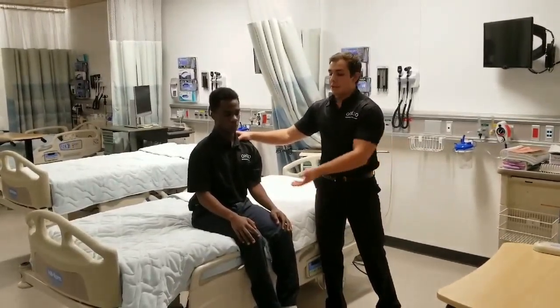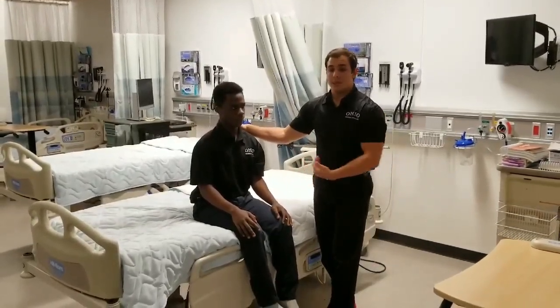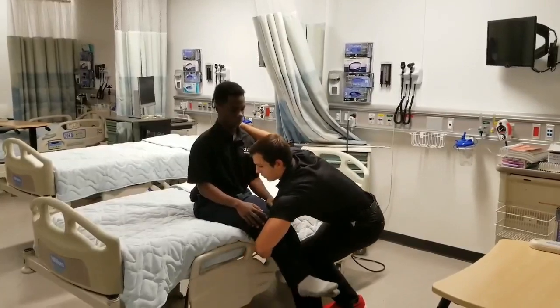In order to get the patient back into the supine position in the hospital bed, you're going to want to pivot the patient back to where his legs are on top of the bed. So you'll reach across their legs again, under their kneecaps, and lift the legs onto the bed. I'm going to lift your knees up, okay? In 3, 2, 1.